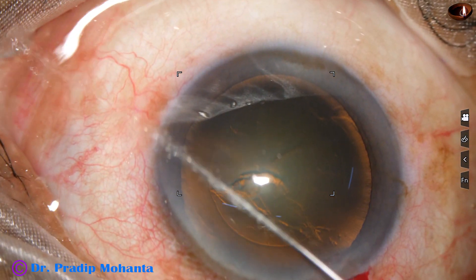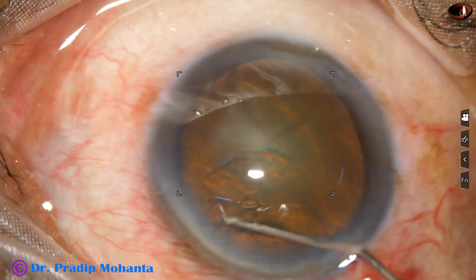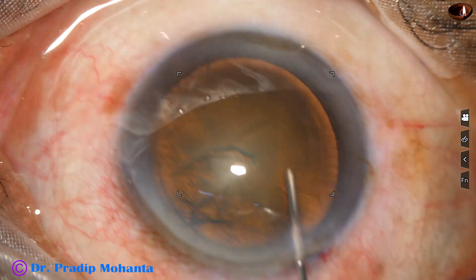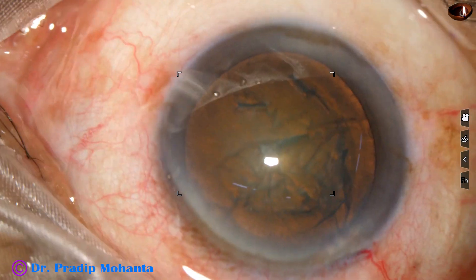Now hydrodissection is done with a 27-gauge cannula and BSS. The nucleus is tapped, and the nucleus rotates.